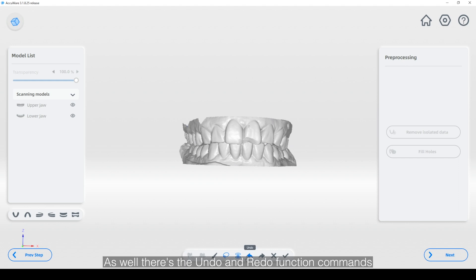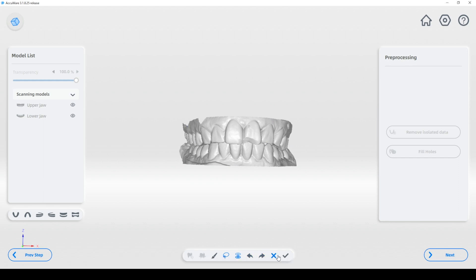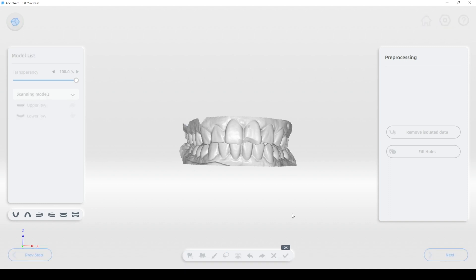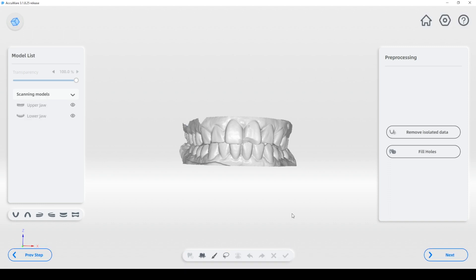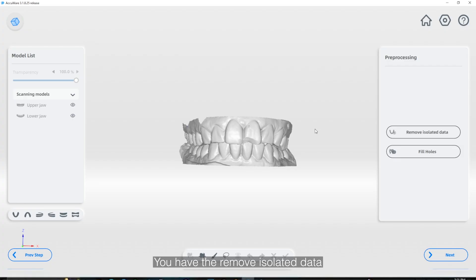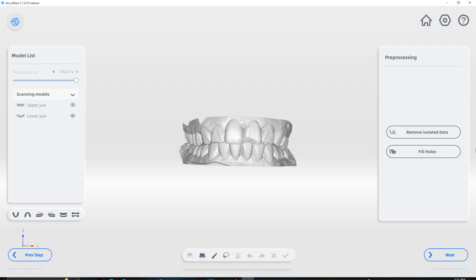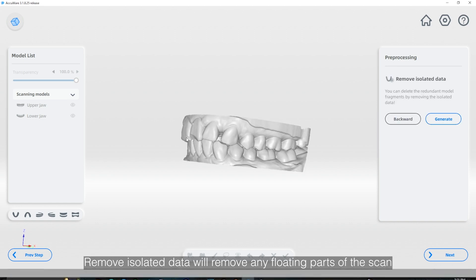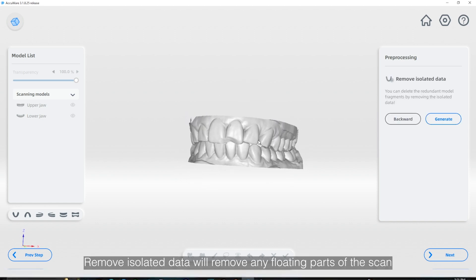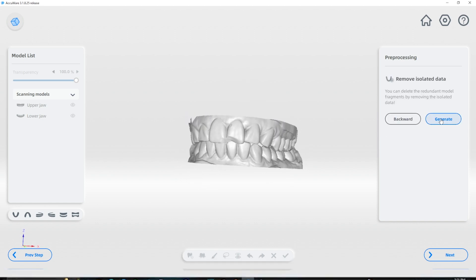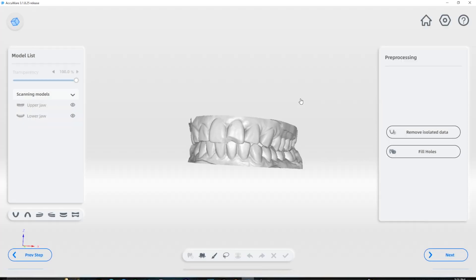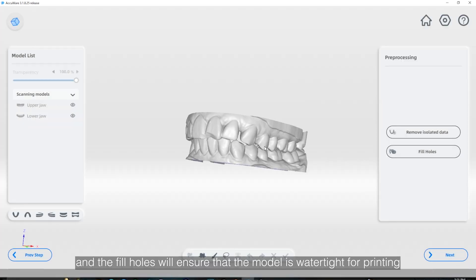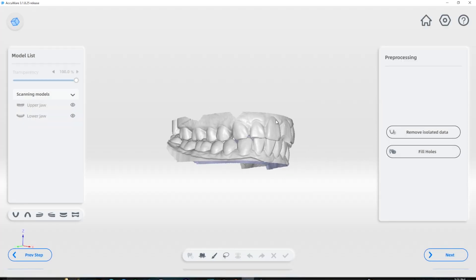There is also the undo and redo function commands and the cancel and accept changes. On the right side of the screen you have the remove isolated data and fill holes functions. Remove isolated data will remove any floating parts of the scan, and fill holes will ensure that the model is watertight for printing.